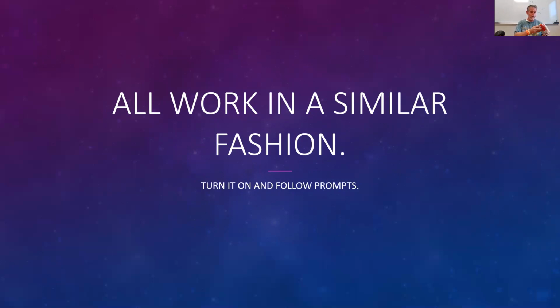The AEDs are all set up where the pad placement is on the pad. So again, I don't know how well you can see that, but it clearly designates that a pad goes here and then one goes down on the left side of the person's chest.